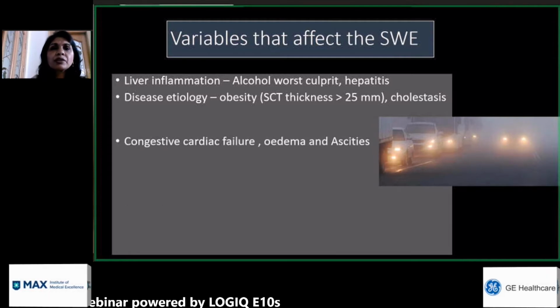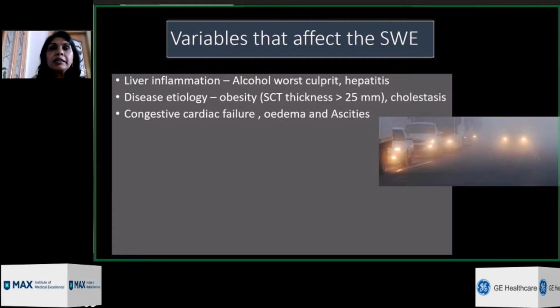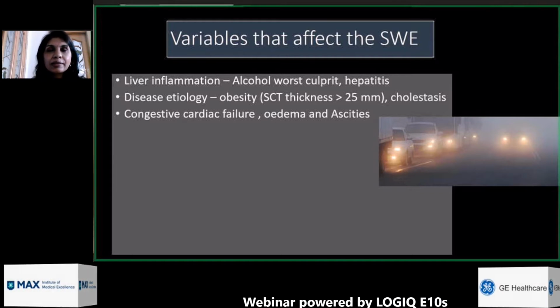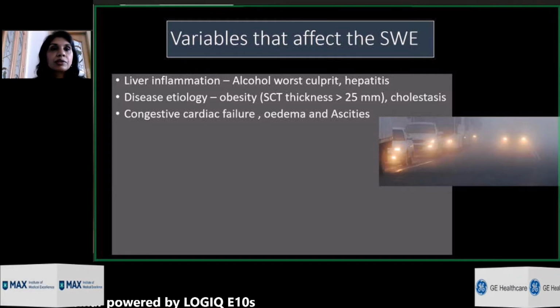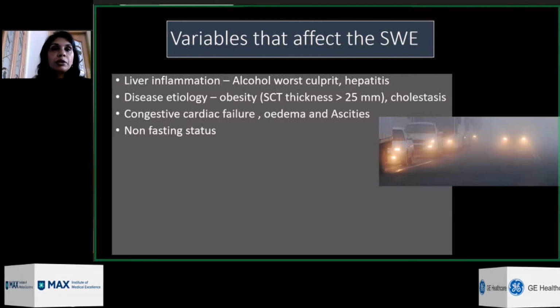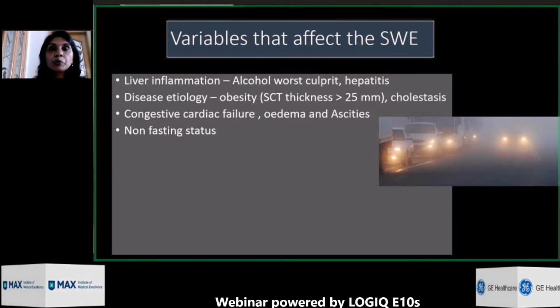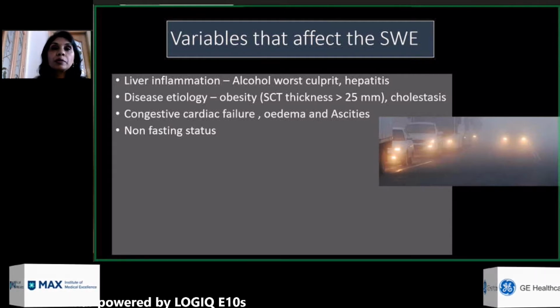And the confounding factors such as liver congestion falsely increase liver stiffness independent of the presence of fibrosis, because the liver is encased, we all know, in a distensible yet non-elastic stiff Glisson's capsule, and this can cause significant variability which necessitates a review under optimal conditions. Then, of course, we need a postprandial status consideration, which means we need a nil orally patient or 4 hours fasting, because postprandial status raises stiffness by increasing the blood flow.